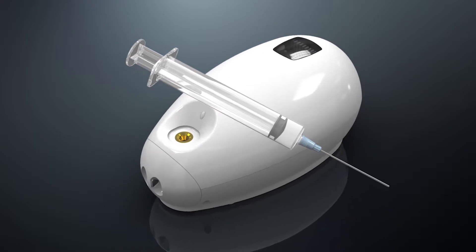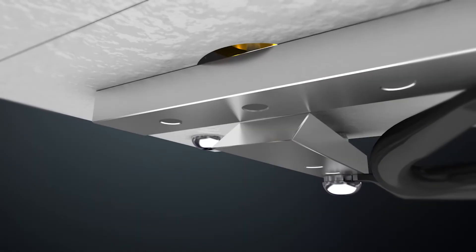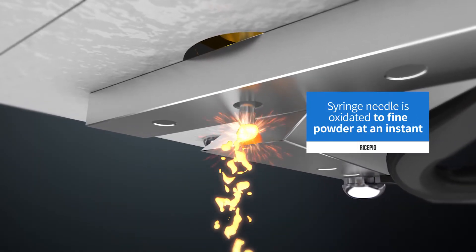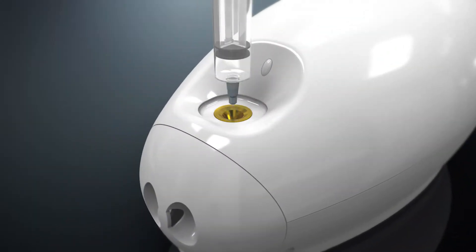A syringe needle used on a patient is blasted with resistor heat of arc plasma with temperatures of up to 15,000 degrees Celsius generated by electricity and the syringe needle is oxidated to fine powder at an instant.